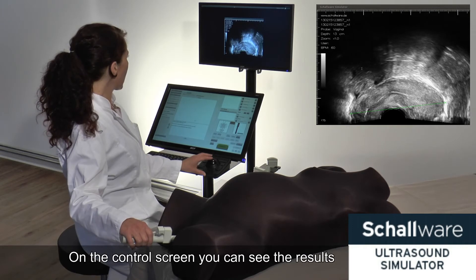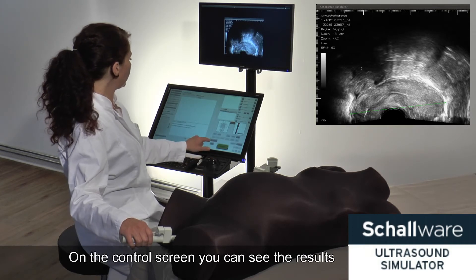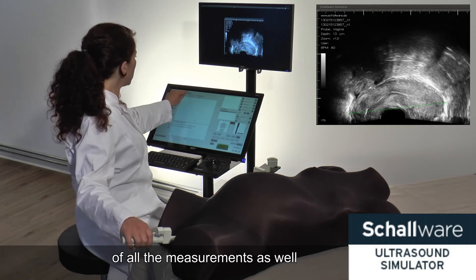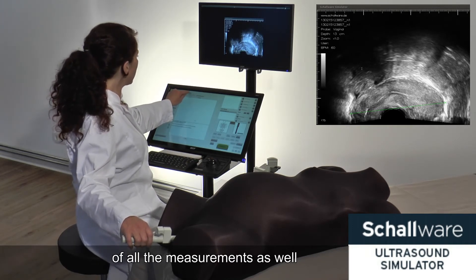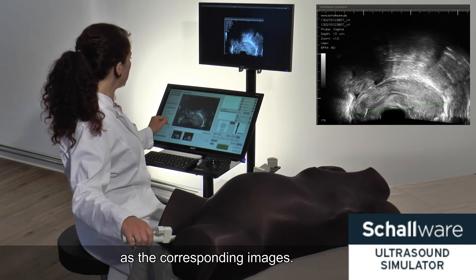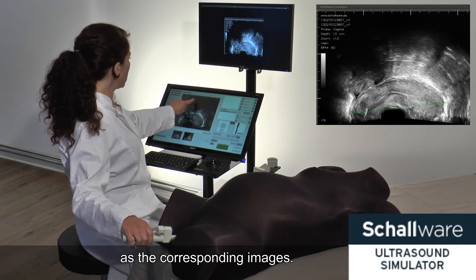On the control screen, you can see the results of all the measurements, as well as the corresponding images.